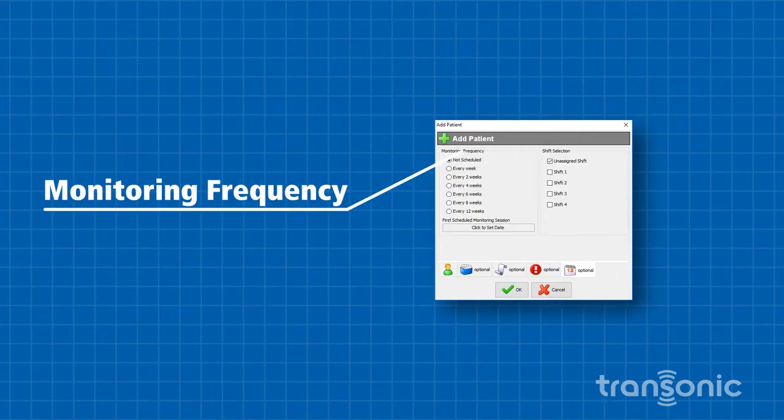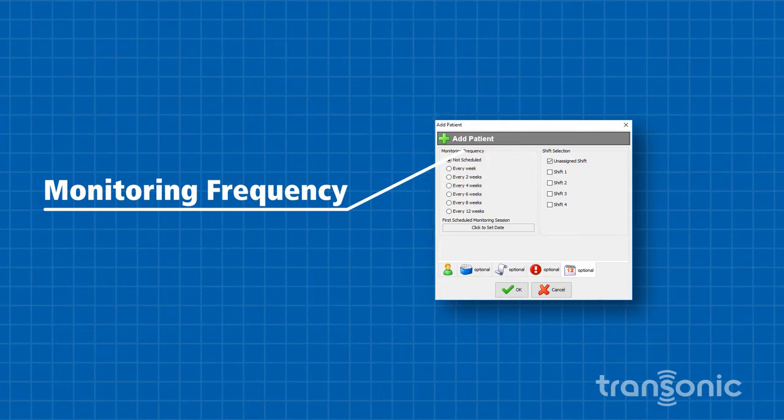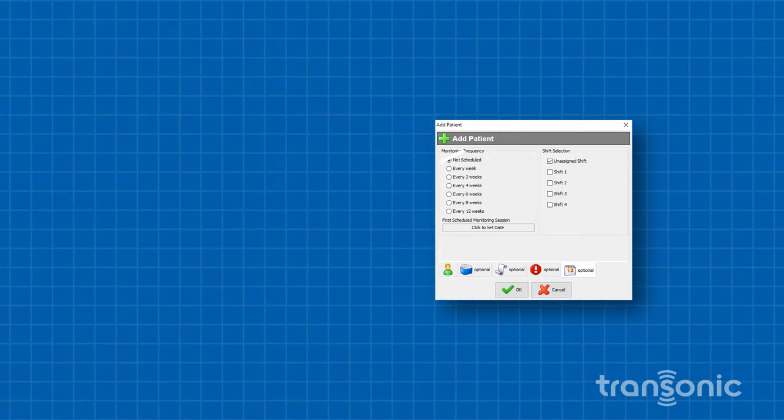Select the monitoring frequency by clicking the appropriate radio button. For example, every four weeks.